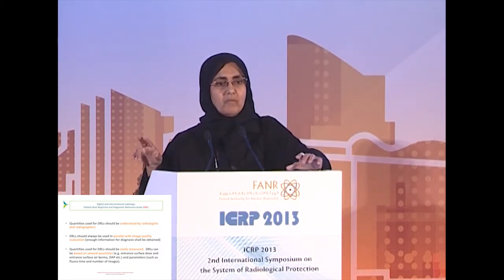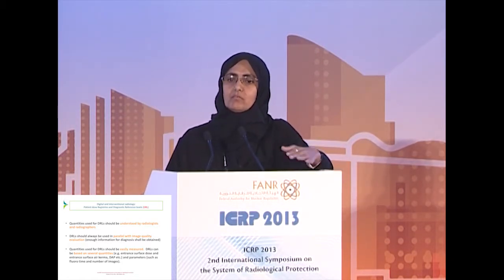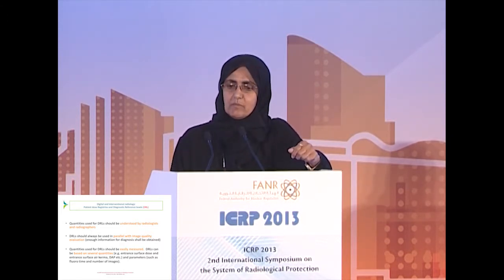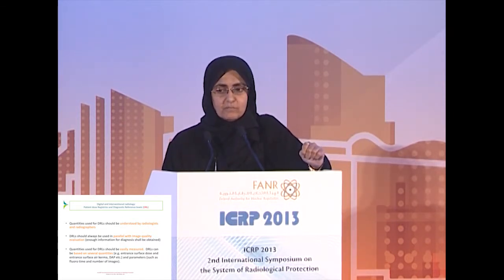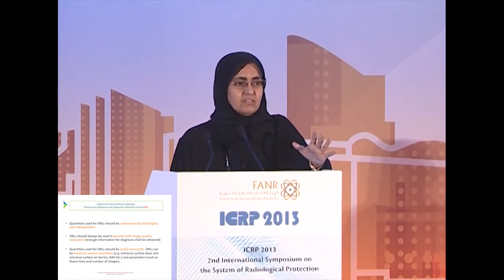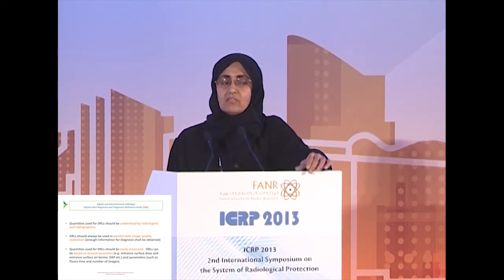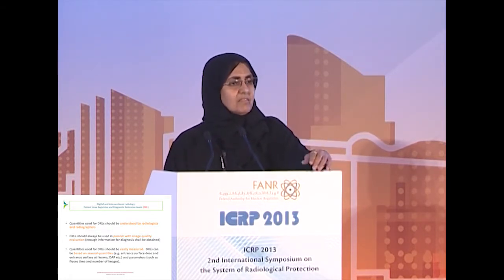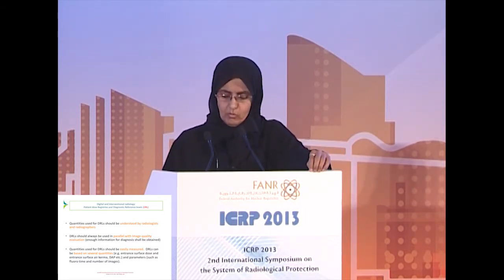DRL should always go in parallel with image quality, so that we don't reduce the dose to a level that we cannot get the information from the radiology examination. The quantity used for DRL should be easily measured. There are a number of quantities in the literature usually used for the DRL, like entrance surface dose and air kerma. Also, imaging parameters are used to set the DRL, like in fluoroscopy, the fluoroscopy time, or the number of frames.